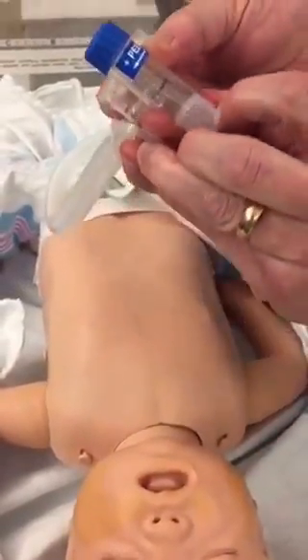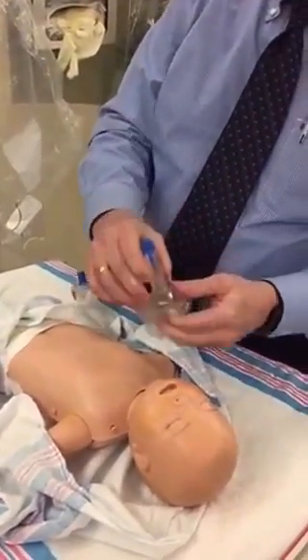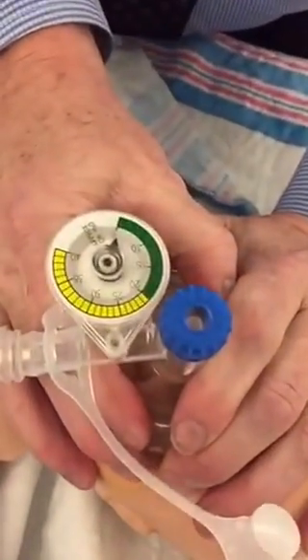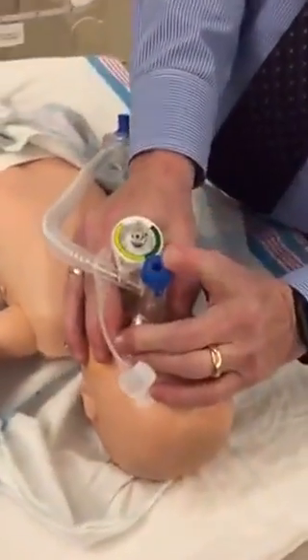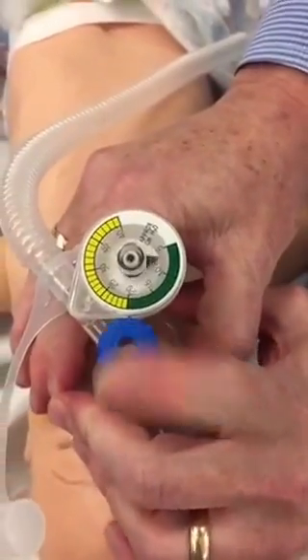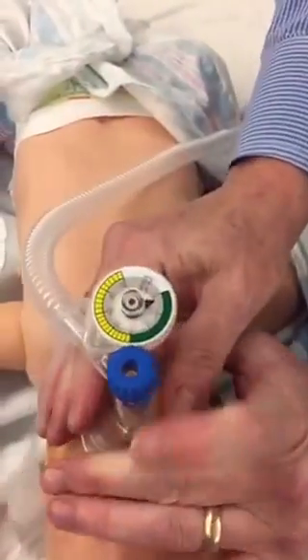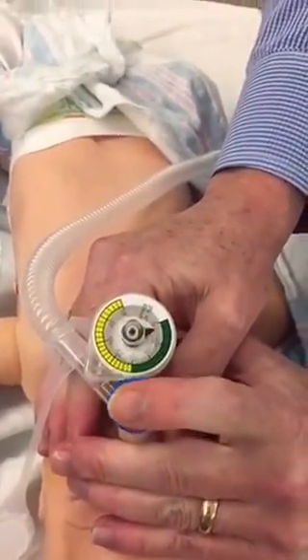I can remove the cap, get the mask, make a nice seal. You can see that I have a good seal because I'm maintaining my CPAP at 5. Now to introduce — I'm just using a thumb. It's a little lower than the 20, so I just increased it on my controller. Now I've got a perfect 20 over 5.